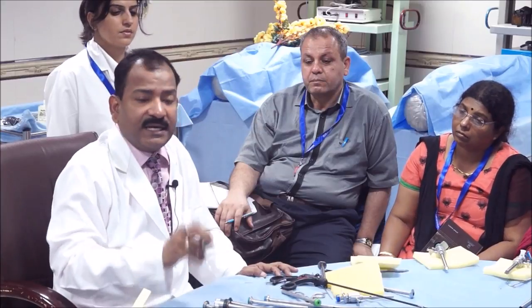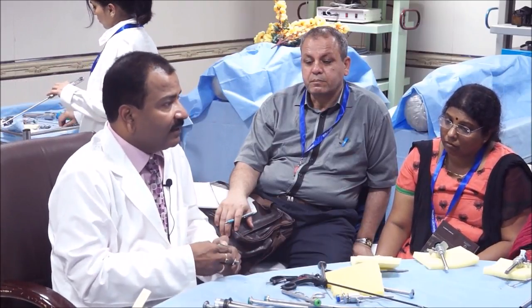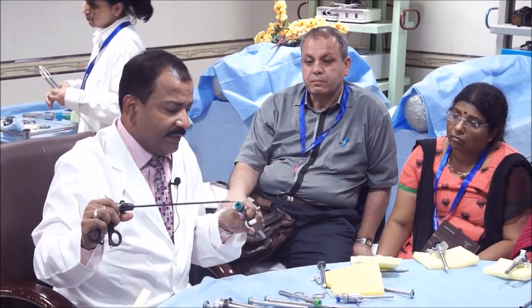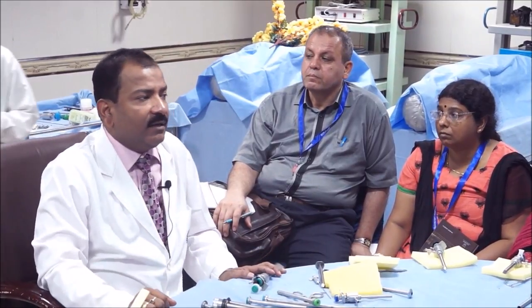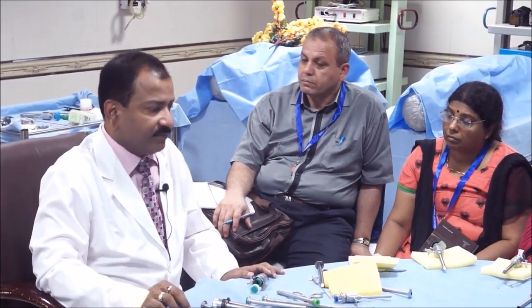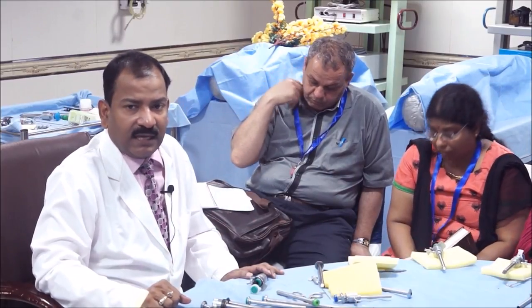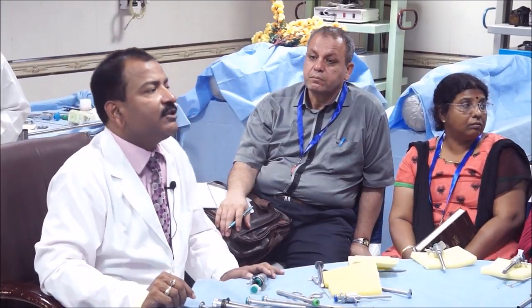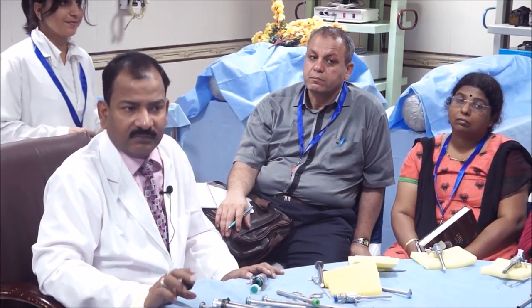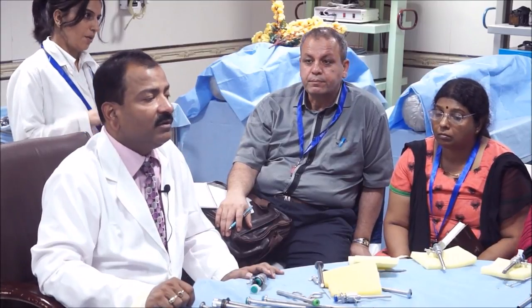Now sometimes if you have a 10 mm port, you will like to reduce that to 5 mm. In those situations, you have to use a reducer, otherwise gas will leak. Suppose this is 10 mm and I use a 5 mm instrument, then gas leaks because the valve is open. Remember one thing: suppose you are doing surgery and your pneumoperitoneum is lost, gas is not retained in the abdomen and the abdomen is deflating, you do not have a working space. Where are the possibilities of gas leak? Around the wound. He is absolutely correct, it means your skin incision is big and it is leaking. How will you know? You can put some saline drops and you can see the bubbles coming out.